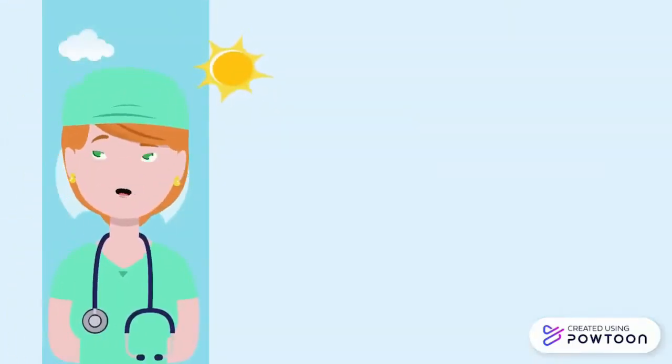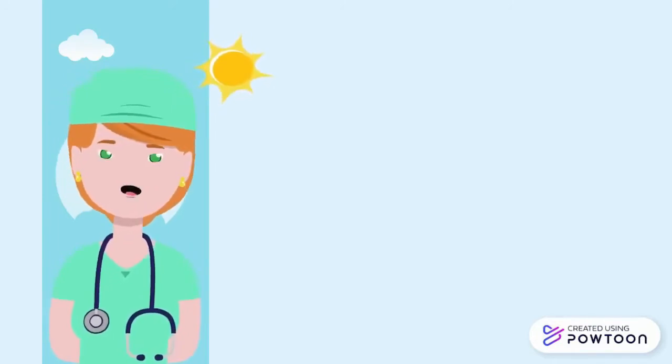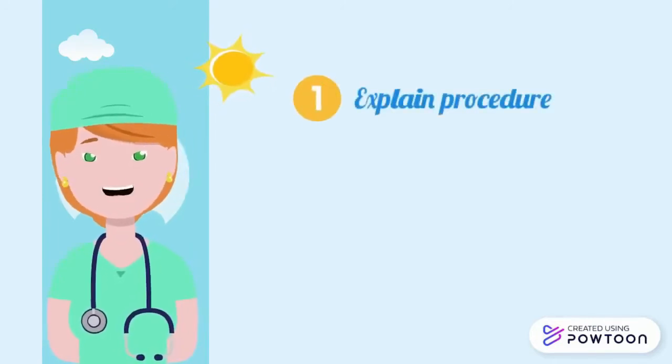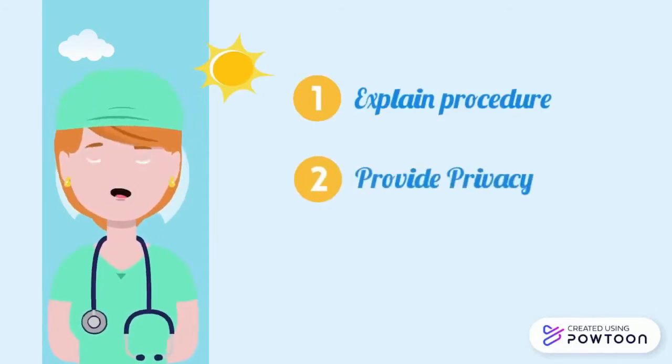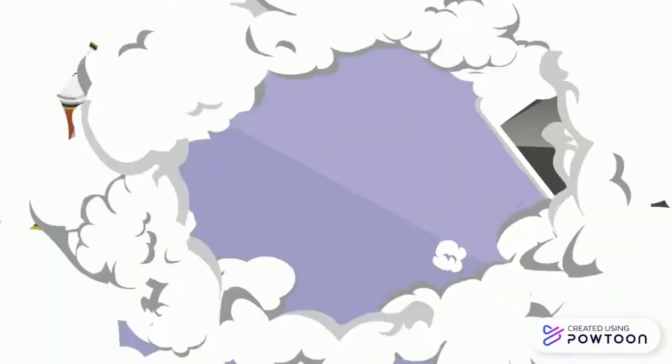As a nurse, we must take into consideration the following before we proceed to the actual procedure. First, explain the procedure to the client. Second is provide privacy. And third, always communicate with a smile.